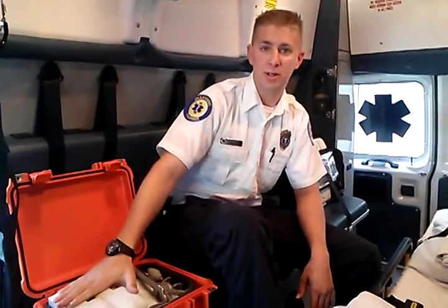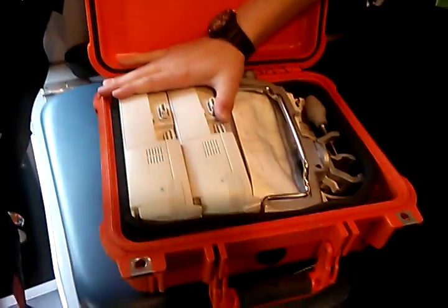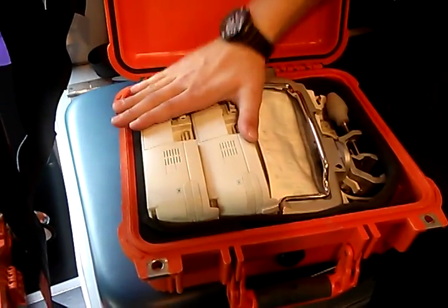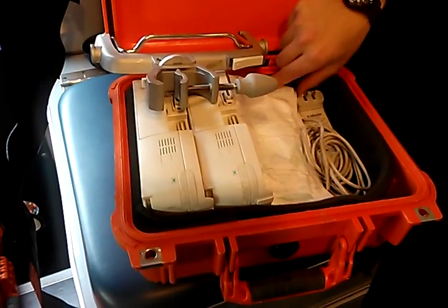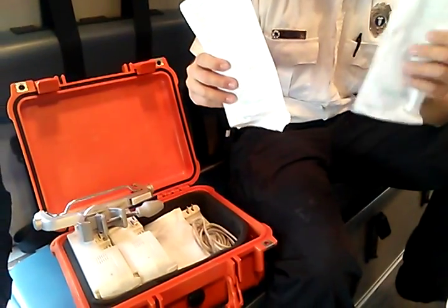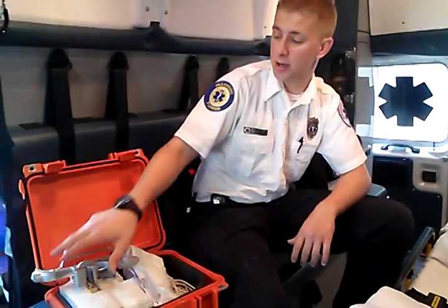First things first — what's supposed to be in your Pelican case? Every ALS unit should have two pumps on it, a holder for your pumps, and one spike set and one add-on set for every pump you have. So I have two pumps, so I have two spikes and two add-on sets for each pump. You should also have a charger located in there.